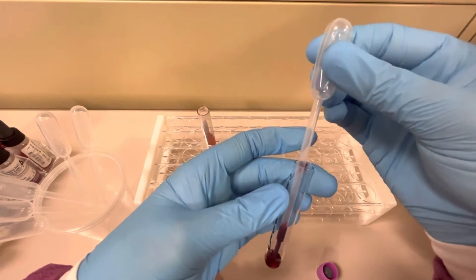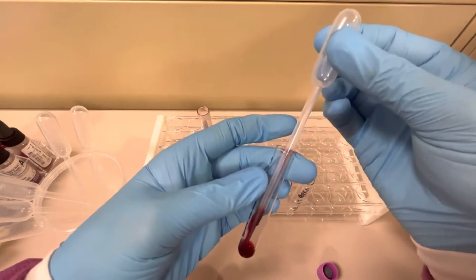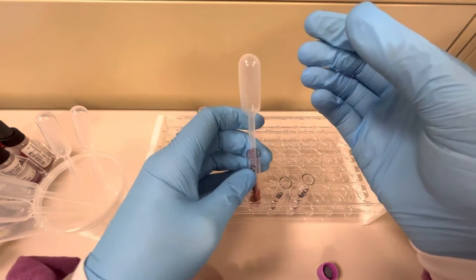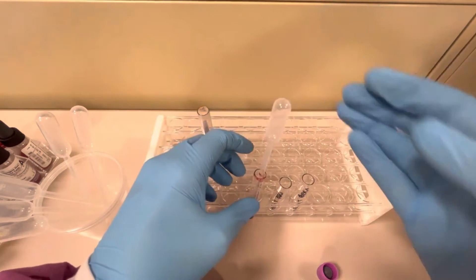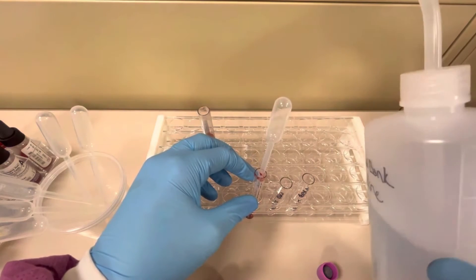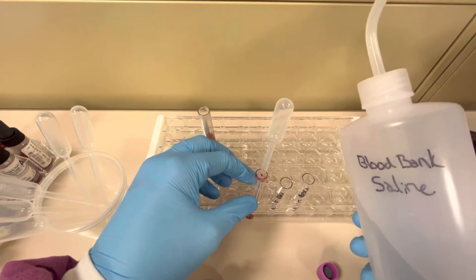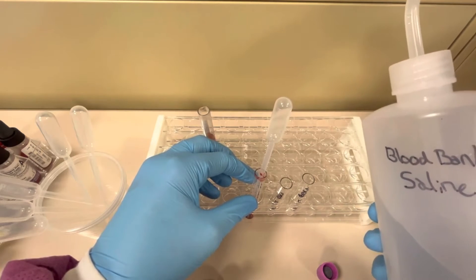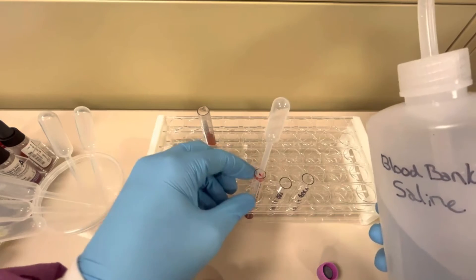If we were just to use straight red blood cells in our reactions, it's going to give us way too heavy of a reaction. It's not going to be working properly. So what I want to do now to make this suspension is I'm going to take this blood bank saline. We cannot use water. It has to be specific blood bank saline.